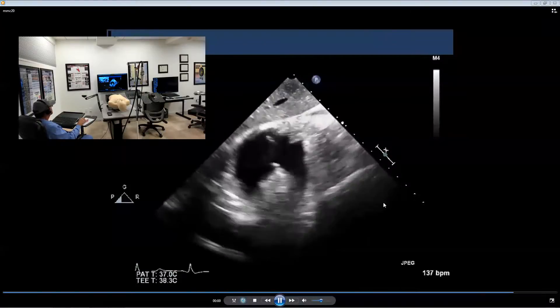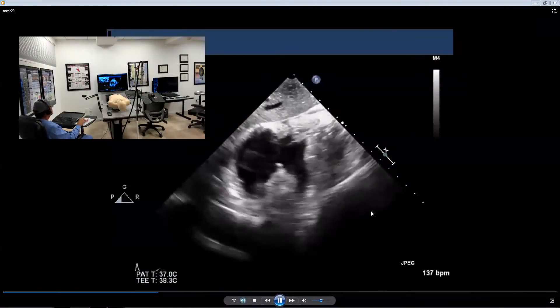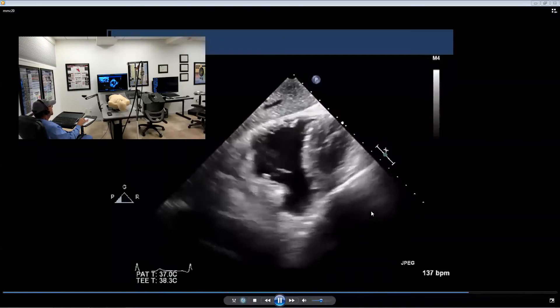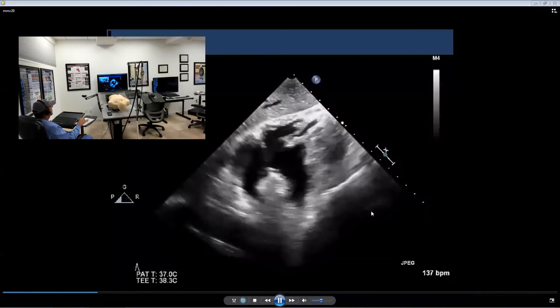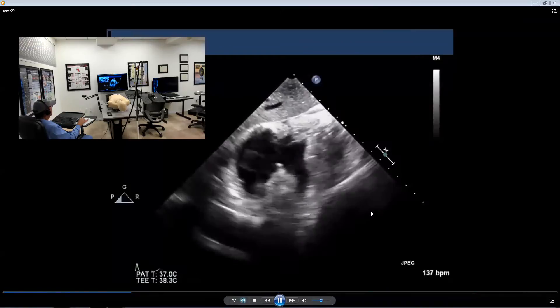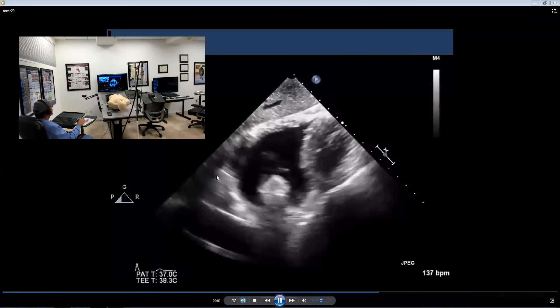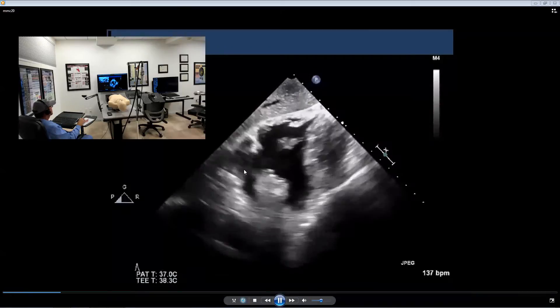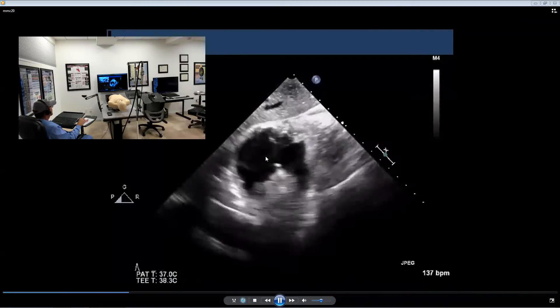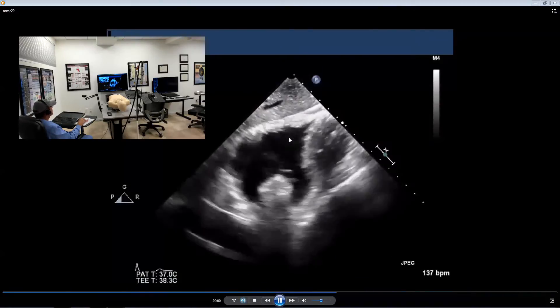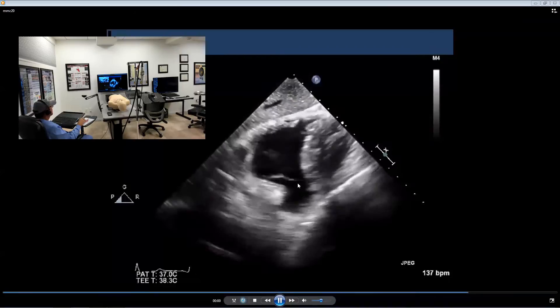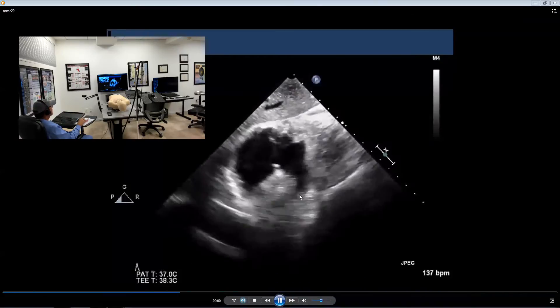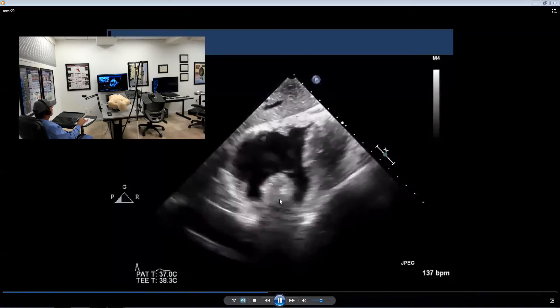Before I hand off the probe to you, let me show you a real ECHO of a transgastric RV inflow-outflow view. In the left sector, you can see the right atria; just below that, the tricuspid valve. Beyond that, the infundibulum of the right ventricle. And here's the RVOT, and beyond that, the pulmonic valve.